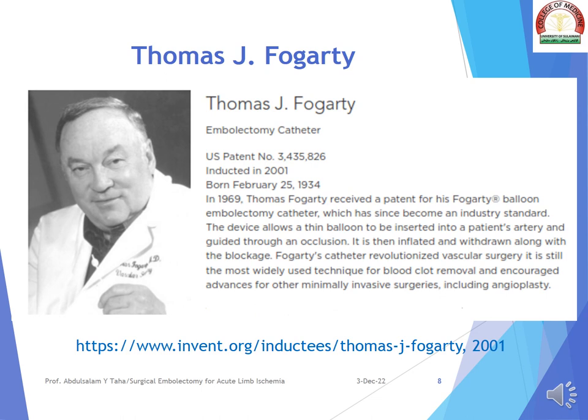Dr. Thomas Fogarty, born in 1934, received a patent for his Fogarty balloon embolectomy catheter, which has since become an industry standard. The device allows a thin balloon to be inserted into a patient's artery and guided through an occlusion. It is then inflated and withdrawn along with the blockage. Fogarty's catheter revolutionized vascular surgery, and his technique is still the most widely used technique for blood clot removal, and encouraged advances for other minimally invasive surgeries, including angioplasty.